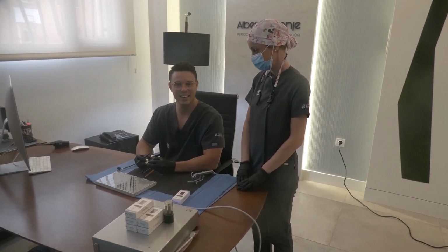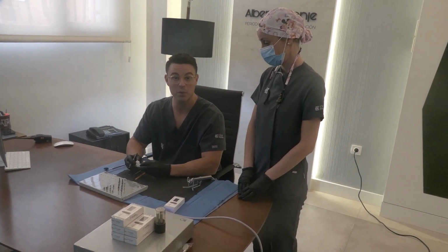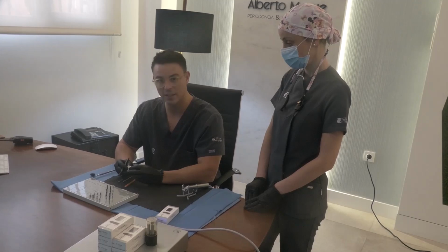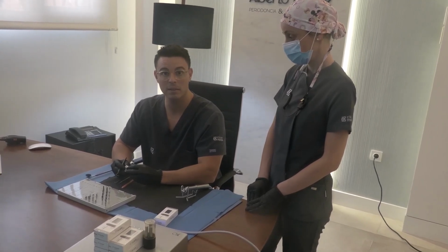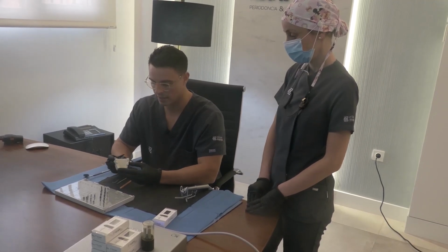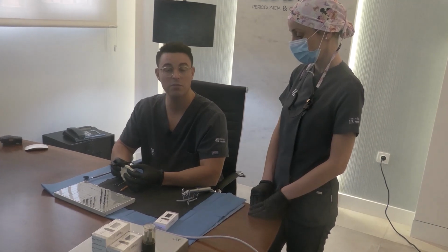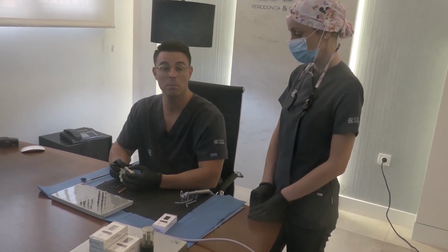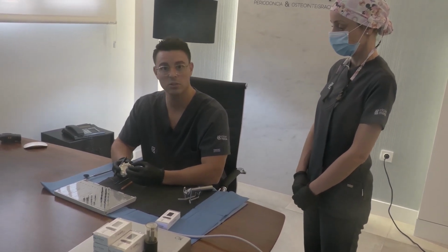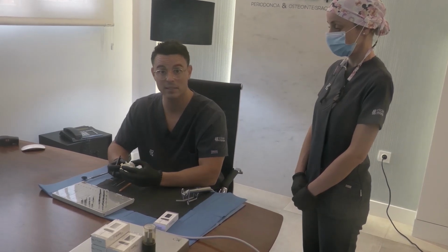Hello dear colleagues, now it's time to put all the knowledge that has already been trained into clinical practice. For that we'll be using a different model, which is a stone model, where we'll be able to place different dental implants, where all the biological and technical principles in terms of position, drilling and placement will be applied in a step-by-step approach.